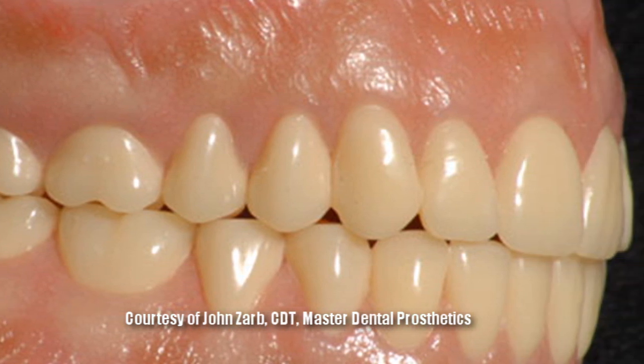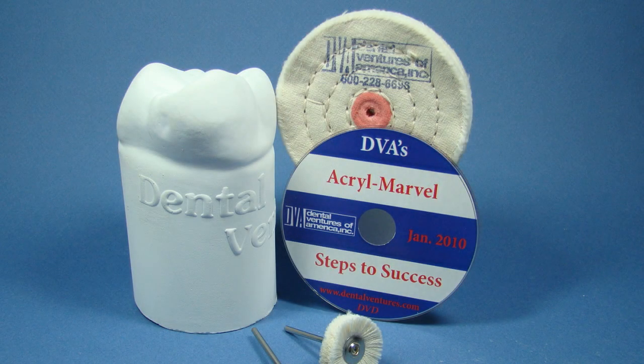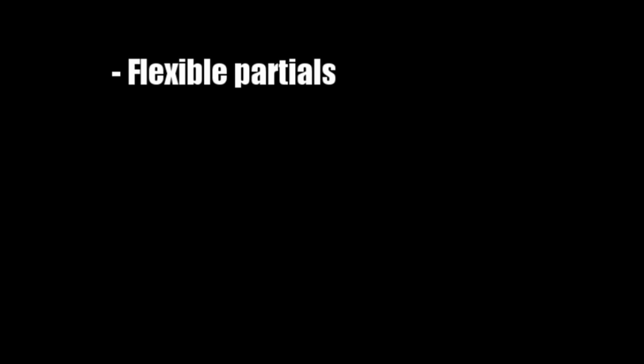Look, this denture is a great example of how such anatomy can be preserved. In addition to demonstrating how effective Acromarvel can be regarding the polishing of dentures and repairs, we continue to learn from our customers how helpful Acromarvel can be with additional procedures. For example, with flexible partials like Valplast, it can help reduce the polishing of these types of materials significantly.